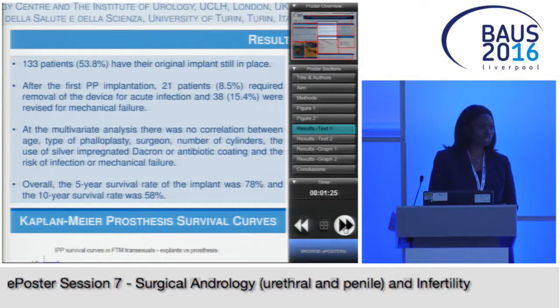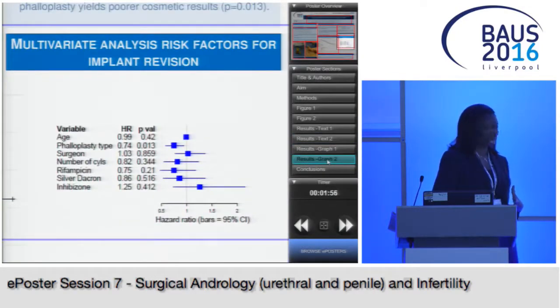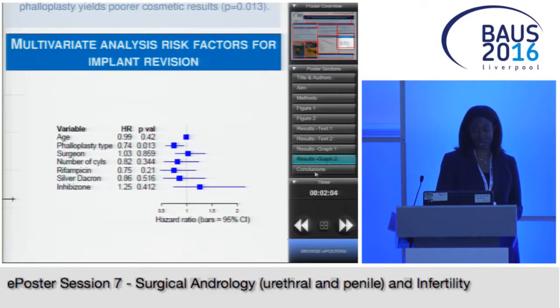However, 8.5% of them had had the implant removed for acute infection, and 15.4% had the implant revised due to mechanical failure. Now, when we looked at the causes of mechanical failure, the most common causes were cylinder rupture, cylinder aneurysm, and tubing rupture in 69%, 19%, and 12.1%. We also looked at whether there are any predictors for which of these patients will need revision surgery, and we couldn't really identify any particular risk factors in terms of which patients will need revision.